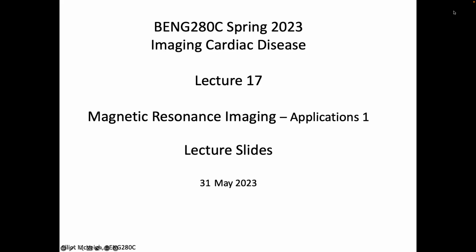And so that voltage really distorts the ECG, right? It's another pattern. It's a fluid mechanical pattern of voltage that's occurring with the blood flow that gets added on top of the ECG. And it really screws up the ECG a lot of the time.